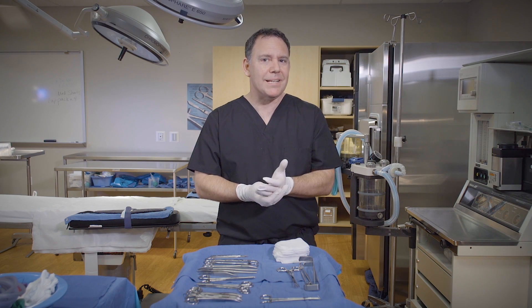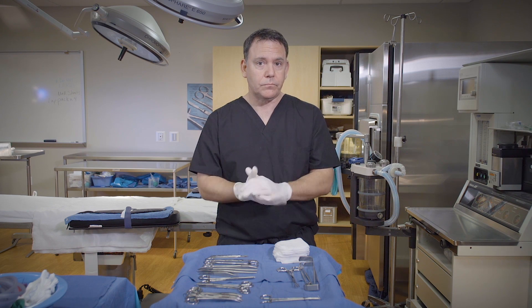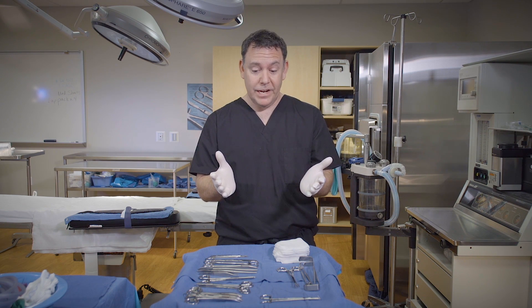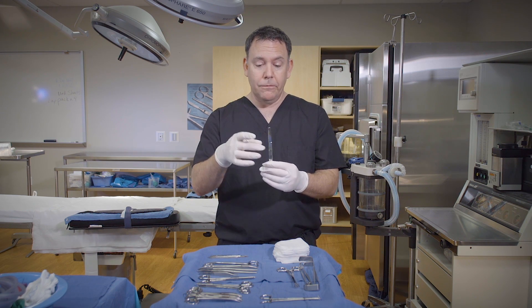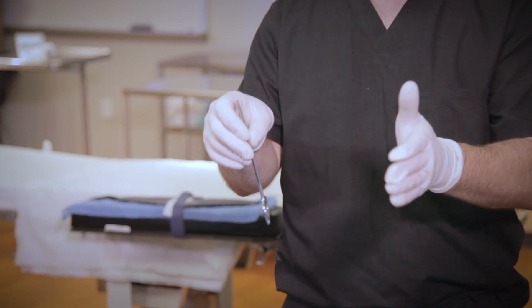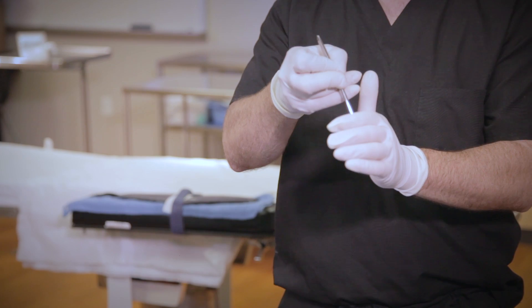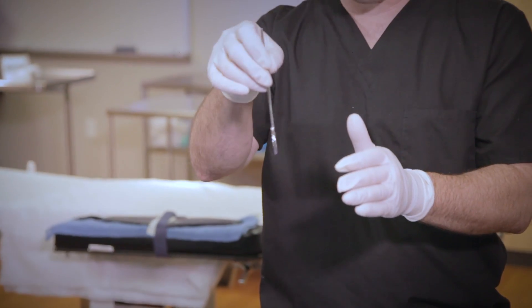When teaching instrument passing, I tell my students to follow four main rules: pass firmly, middle finger on the box lock, pass the instrument straight up and down, and pass it in position to use. For most of our basic instruments, it looks like this. Starting with the scissors — straight up and down, my middle finger's on the box lock, and I'm going to press firmly. The surgeon's hand is like they're shaking your hand, just like that.